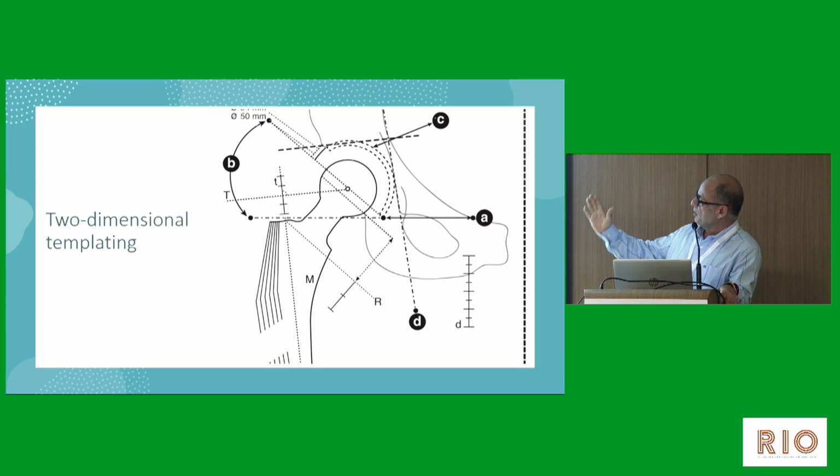So as I said, if you have a neck shaft angle which is high, then your offset decreases. So your stability may be less, but you can achieve the same stability by increasing the horizontal offset and position of your cup. So if your cup is more lateralized, you can make it tighten, although you may not change the length in such cases.